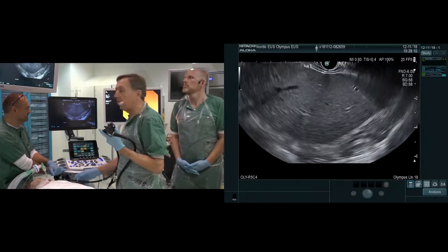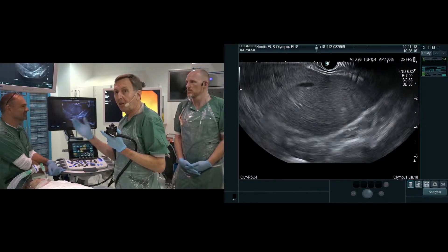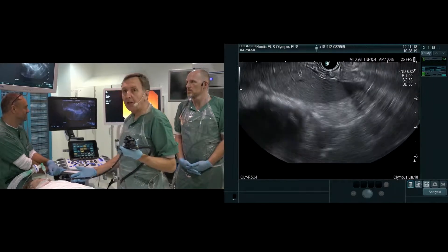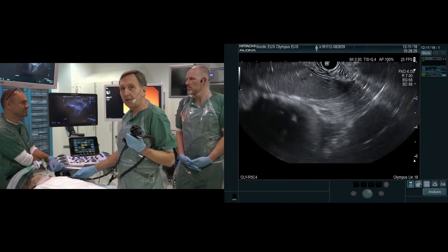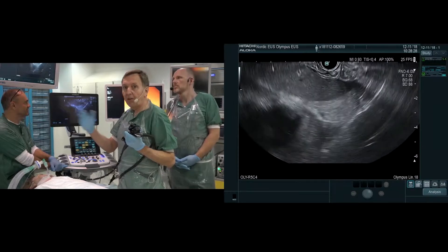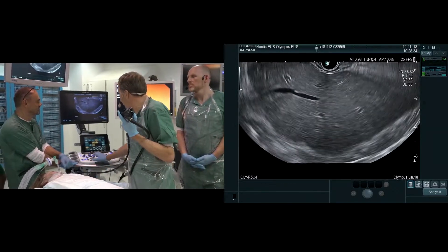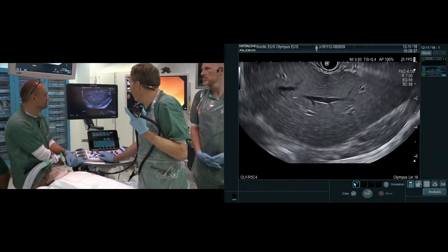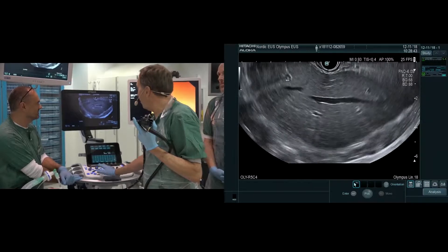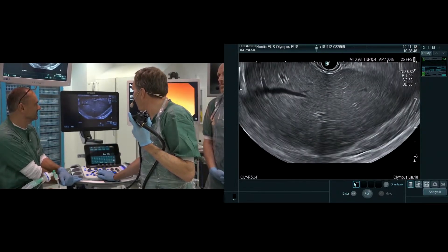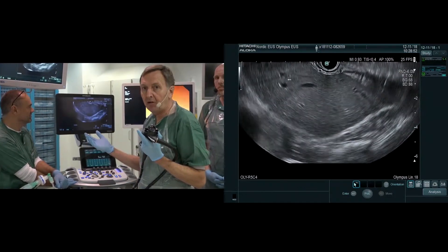You see the left liver lobe. I make rotations with the instrument and you always have to look that your instrument is straightened, otherwise the transducer will not move within the body. You have a look at the left liver lobe — you see here the liver veins and the portal veins inside with a very typical echo-rich border. And close to them you see very small intrahepatic bile ducts. So, you can say there is no intrahepatic cholestasis.